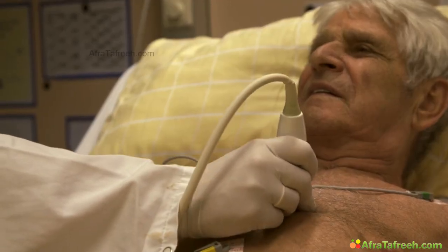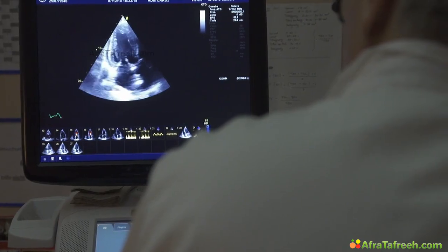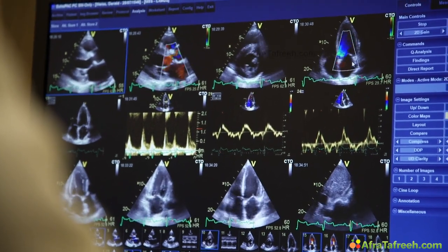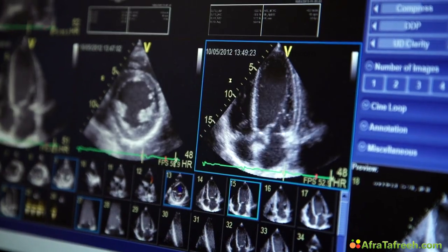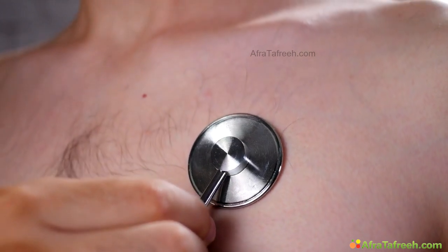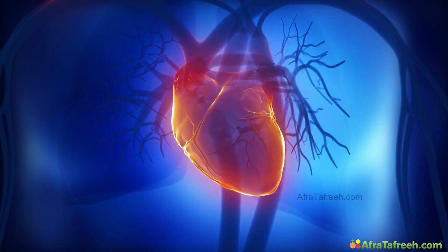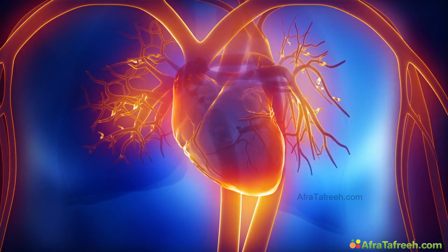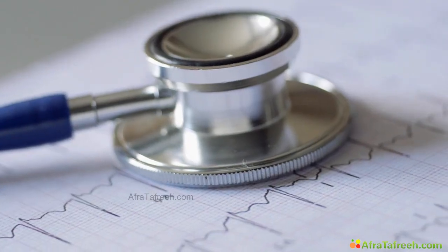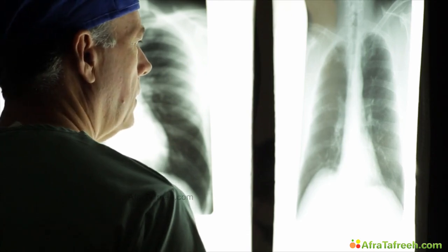Ultrasound plays an important role as a frontline diagnostic tool. Observing the contraction of the heart easily allows you to diagnose heart failure in many patients. As a matter of fact, ultrasound is more sensitive and specific compared to the physical exam, the ECG, and even the chest X-ray. So ultrasound is important in patients who have symptoms of cardiac disease, but also in asymptomatic patients where physical findings, the ECG or the chest X-ray indicate a problem of the heart.